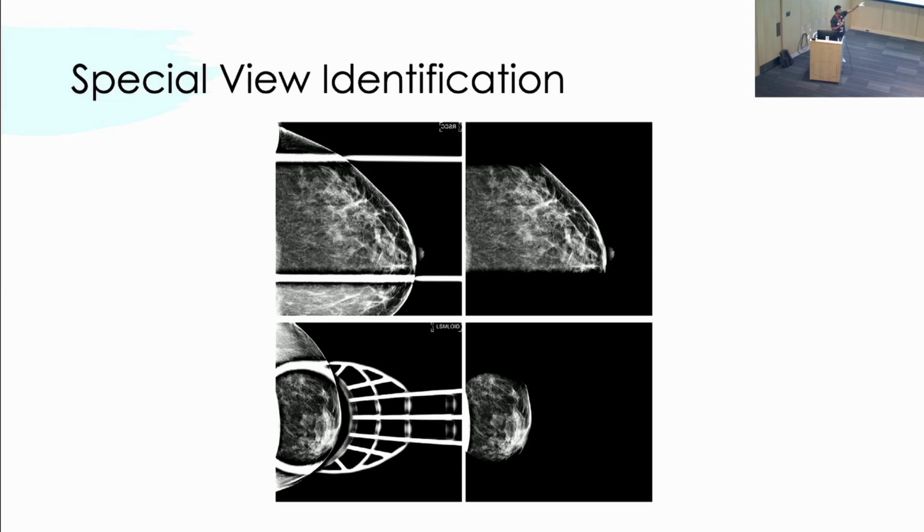Somewhere laying around, I think we have the masks of the tissue actually extracted, but that might be too much for the datathon. But at least if you're going to use diagnostic mammograms, you know which diagnostic mammograms have paddles and which ones don't, so that you can treat them separately, right? You could take all the diagnostic mammograms with paddles, and if all of them have paddles, you could train a model for that and say cancer, no cancer. Question?